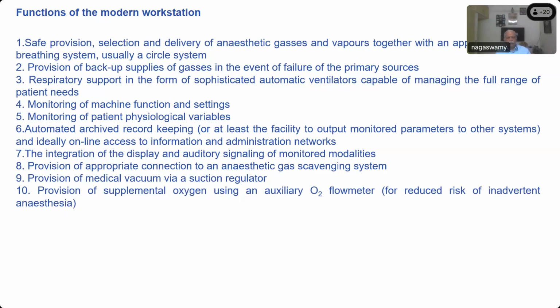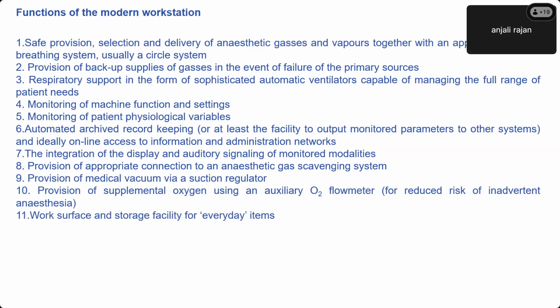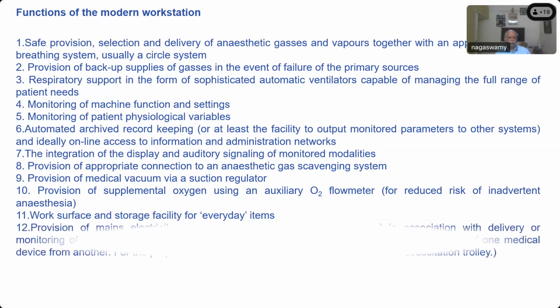What is the peculiarity about this auxiliary oxygen flow meter? Without switching on the machine, we can use it. Excellent. It doesn't require you to switch on the machine. Even when the power is switched off, you use that, it will automatically work.